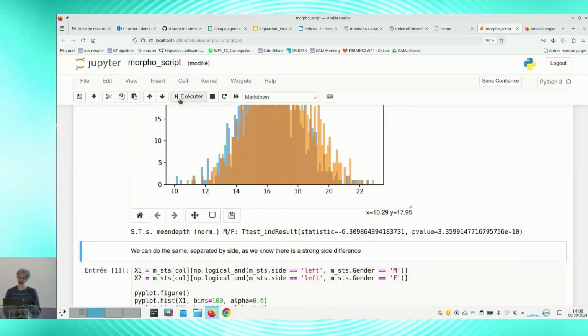It doesn't mean less gray matter, it means that the sulcus is less deep, in a normalized space, because they are measured here in a normalized space.